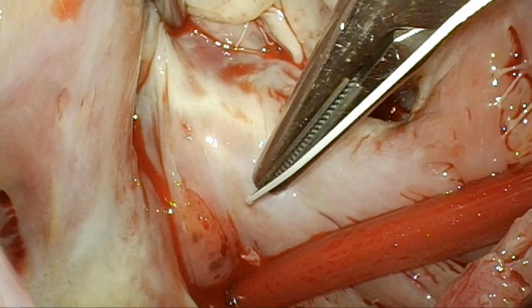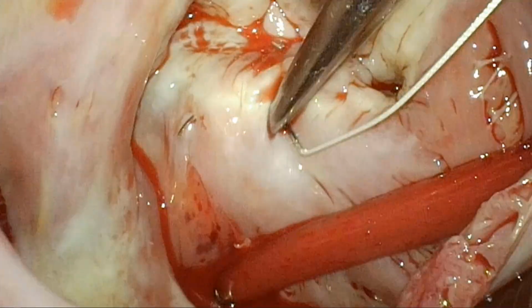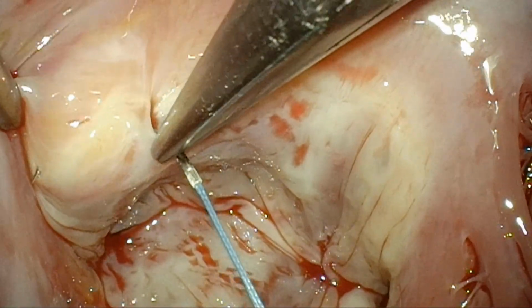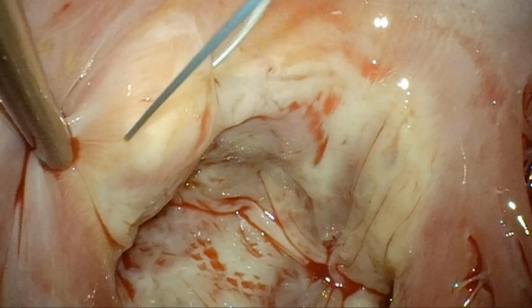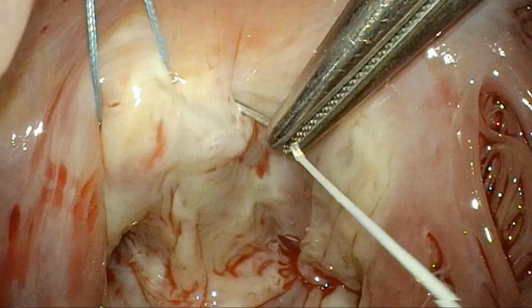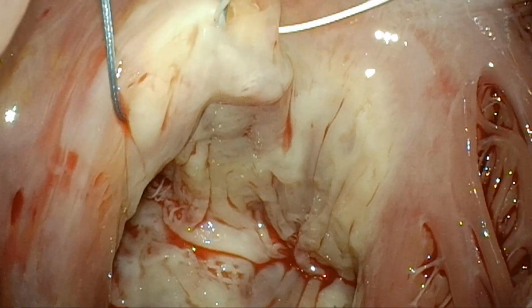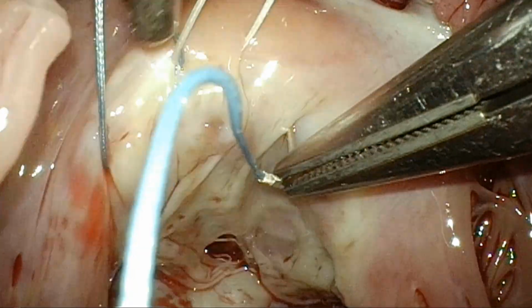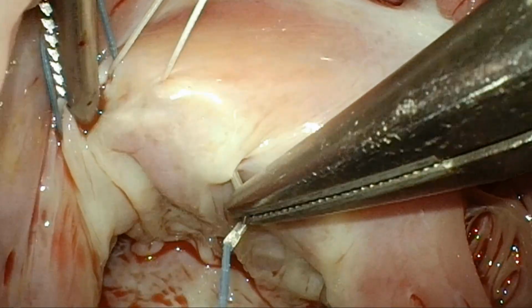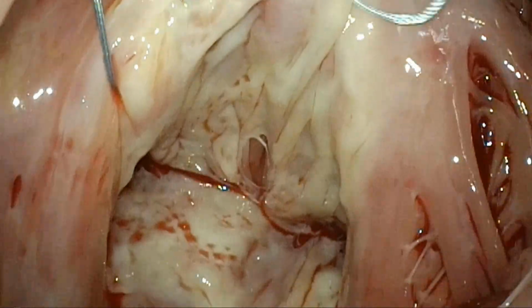We start always by putting the 6 o'clock suture, because this is the most important suture. We put this suture first, the 6 o'clock, so you know you're not going to go beyond. And then we put the 9 o'clock or 11 o'clock or 10 o'clock. That depends on how big the aortic root is, because you don't want to put a suture near the aortic sinuses. The sutures have to be good sutures. This suture is a cross suture. That's not intentional, but we don't mind interlocking the sutures in the tricuspid, because we think this will actually augment the annuloplasty and make it more stabilized.